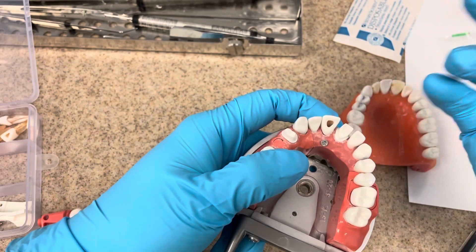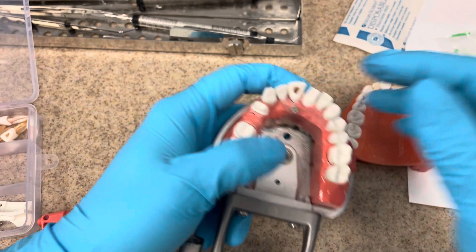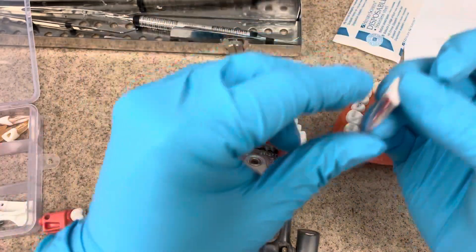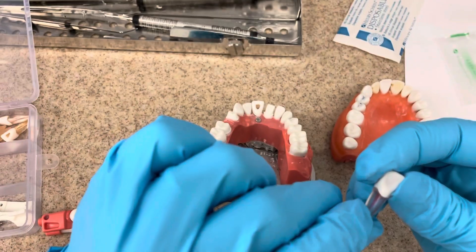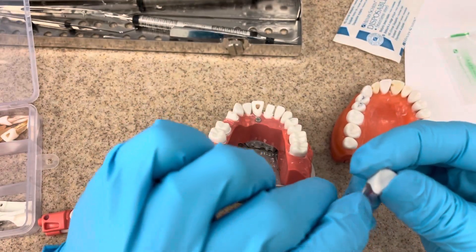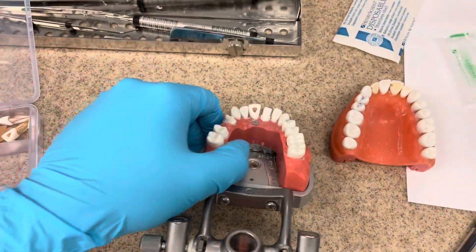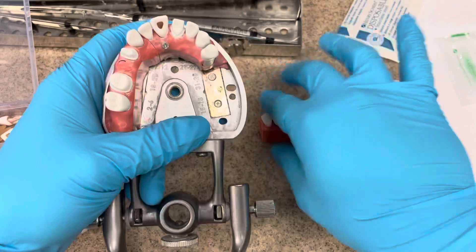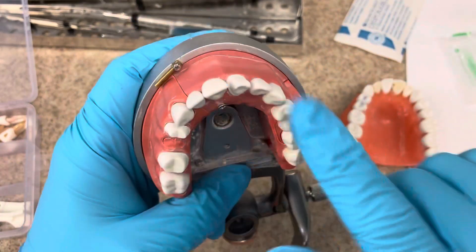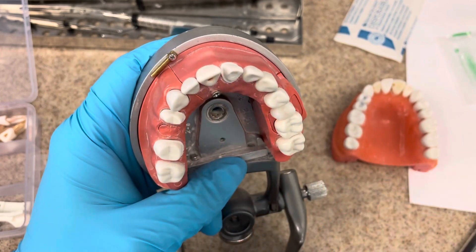Obviously, number eight you're just going to unscrew. When you look at number eight, you'll often see a little mark where that screw lands. Since this is a new one, you're not going to see it. This will get you covered for the first day, or the endo PROST portion of the exam.